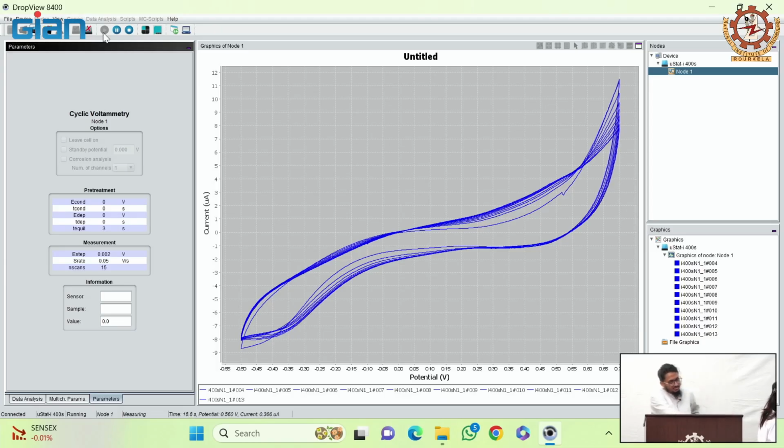And during calibration we will be using amperometry. So, the sensor reading will be taken using amperometry. Okay. So, you can see how various steps are used: CV for functionalization, CV for testing, and then amperometry for reading or measurement.